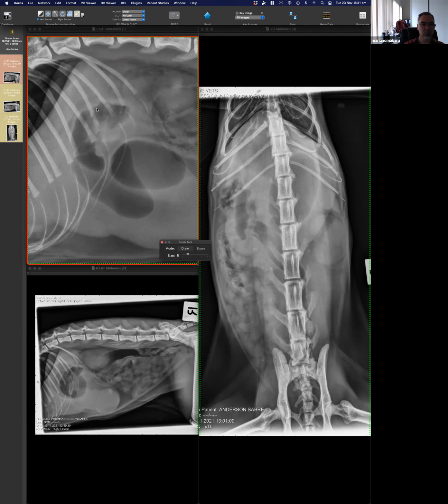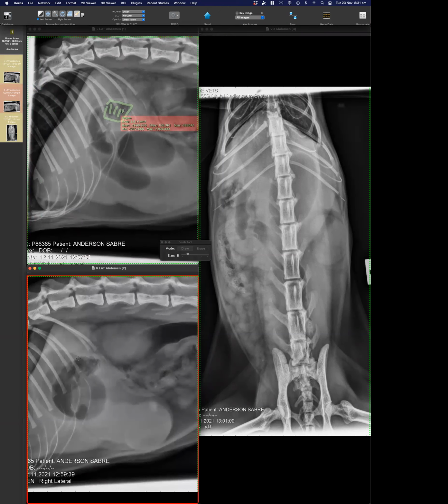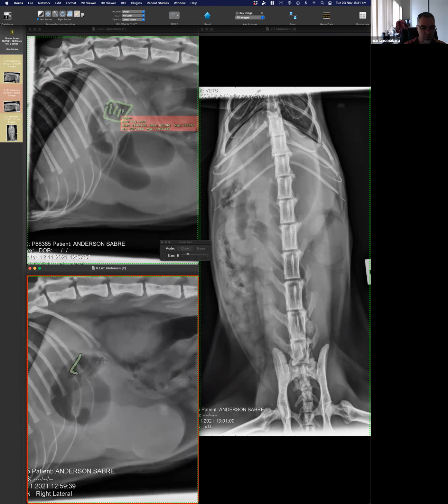So this seems to be like gas within a tube, and it is more homogeneous. And then there's kind of an abrupt angle here, and then something more kind of square. And then the pattern here is not so homogeneous. Again, it would be perfectly fine for you to say, I think you are crazy, or I will never have the confidence to make that call. And I will completely understand that point.